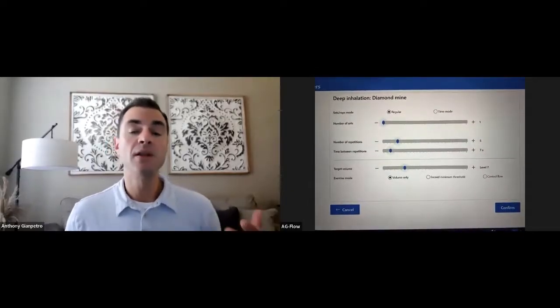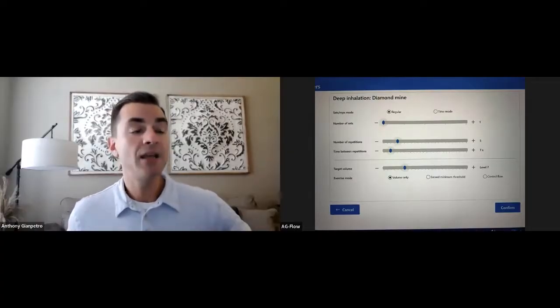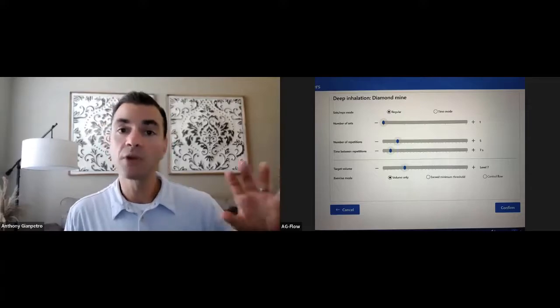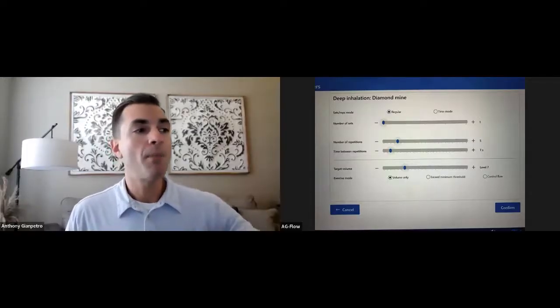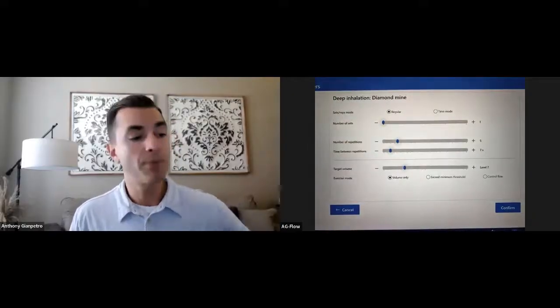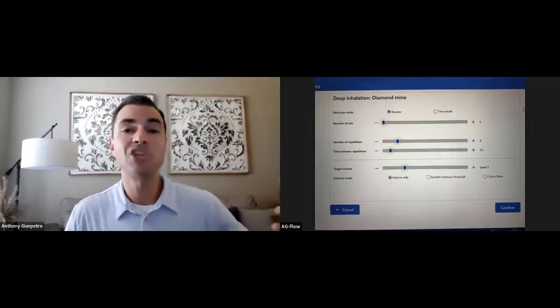But this is really the nuts and bolts of what I wanted to discuss with you today for each activity. And if you play with this a little bit, a lot of it is very intuitive. So if you're a little overwhelmed by this at first, rest assured that the more you practice with it hands-on, you'll be able to self-teach. But notice the first thing is starting off with regular mode or time mode. Most people are going to want to go with regular. And I think a lot of that is because it's just easier.